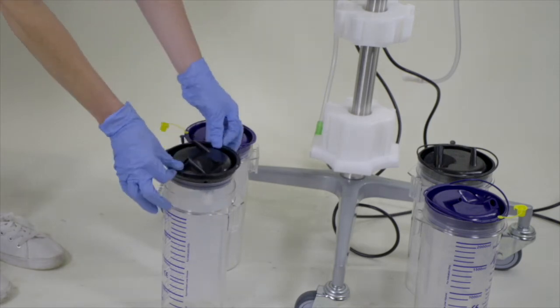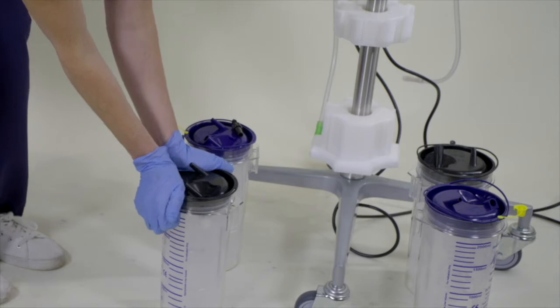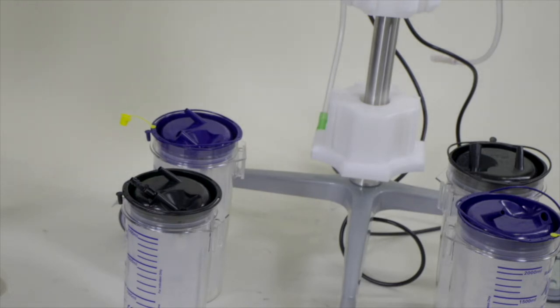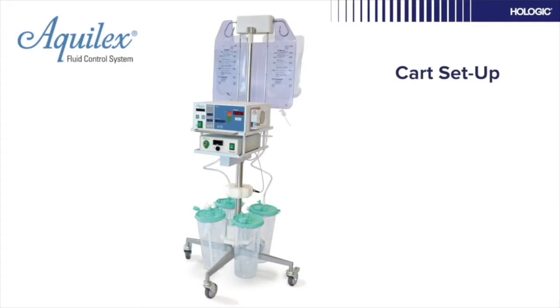Now insert the liner into each canister by pushing down around the edges of the liner to ensure a tight seal. You will need an adapter for the black canisters as shown to connect the reusable vacuum tubing. We are now ready to assemble the canisters onto the cart.